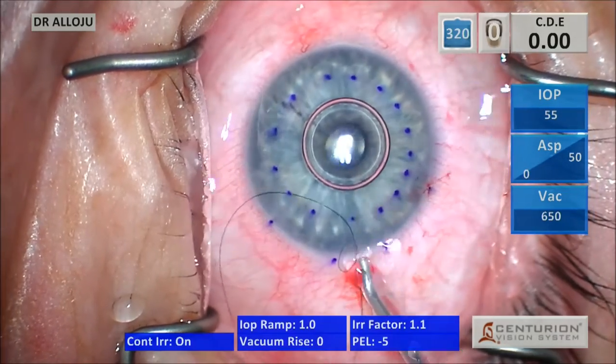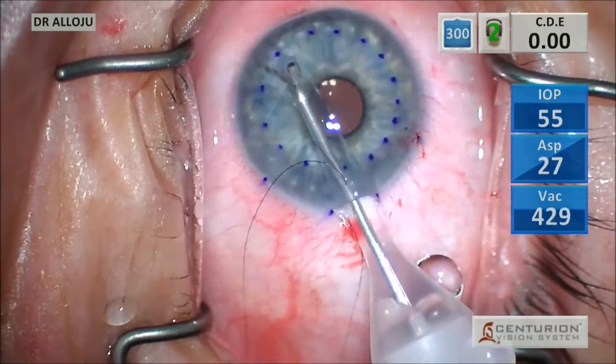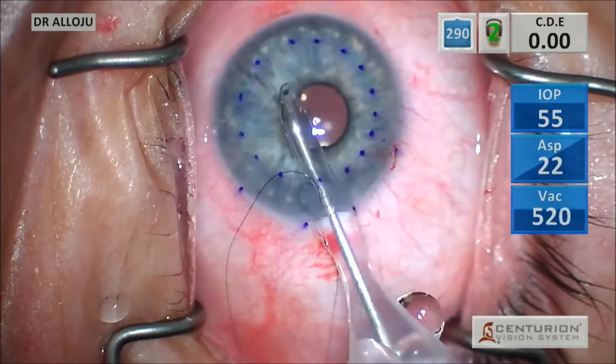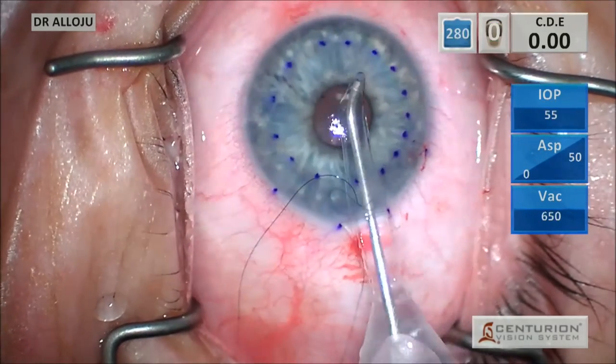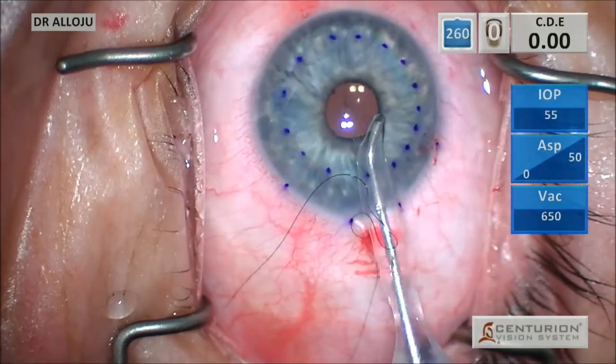So now I'm going in with my I/A and essentially removing as much of the viscoelastic as possible, and then I'm actually using the I/A to essentially remove or kind of suction along the stroma here.